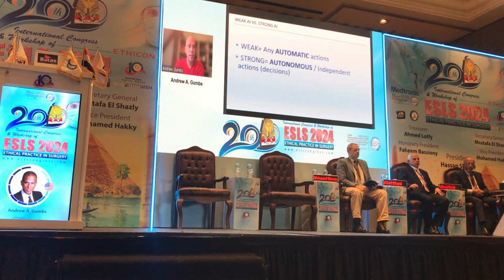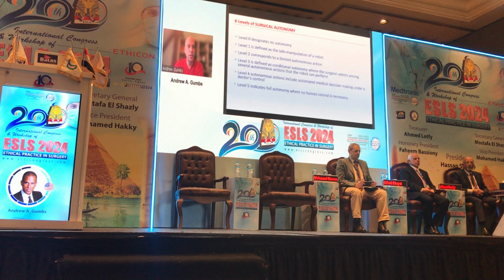First off, people have a hard time, including myself before I started doing this research, with the difference between automatic actions and autonomous actions. Automatic actions are you hit a button and something happens. Autonomous is there is some independent decision making, some sensor, some analysis, some interpretation that happens before the action actually occurs. So the best way to understand this is when we look at the 6 levels of surgical autonomy, again, as I mentioned, that are based on the 6 levels of autonomously driving cars.